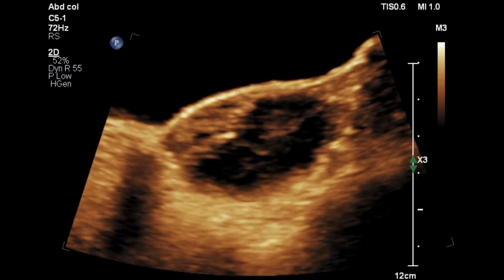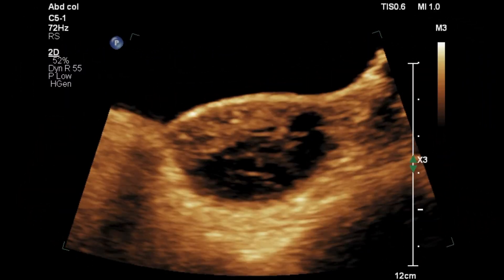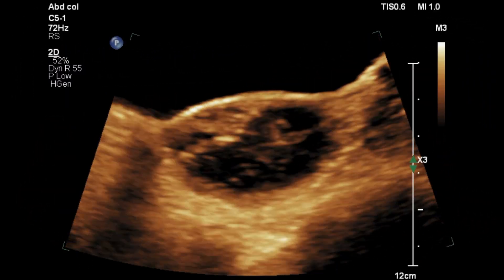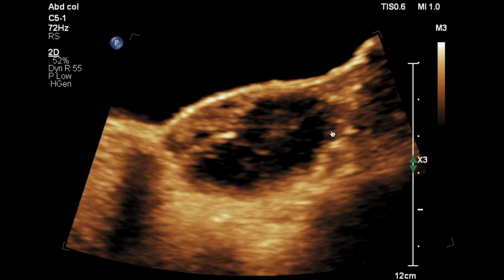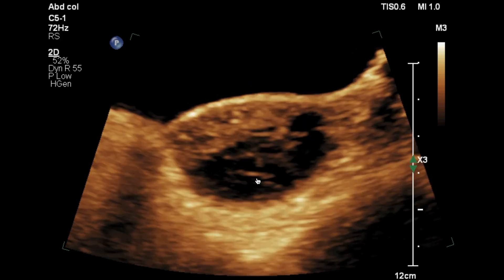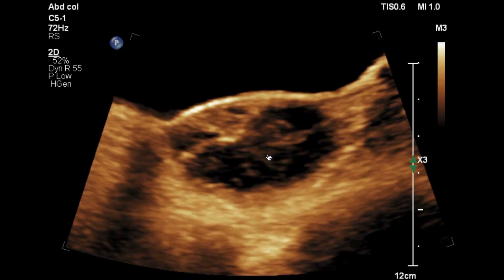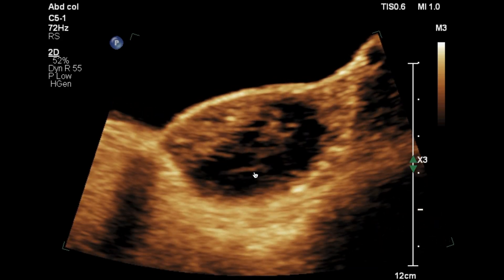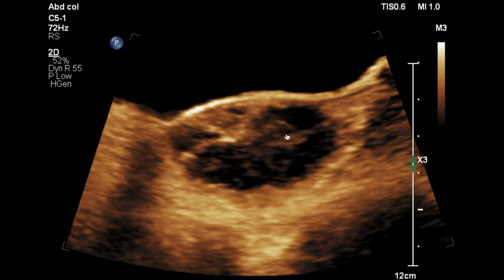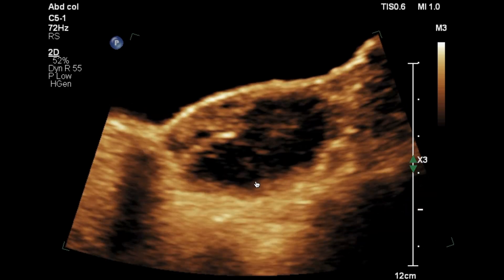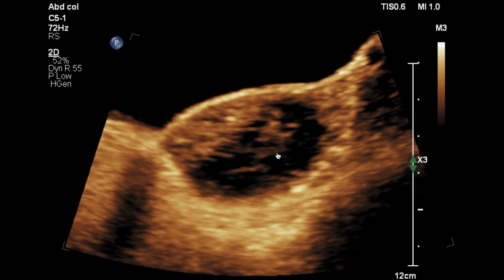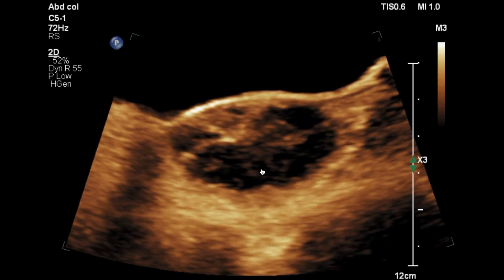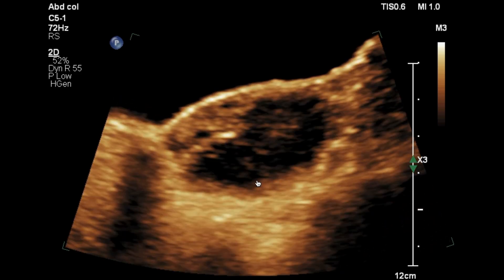Here on the magnified image you can see the internal septations are quite well visualized. These are thin septations. This type of lace-like pattern or reticular pattern within a cystic lesion goes in favor of hemorrhagic cyst.